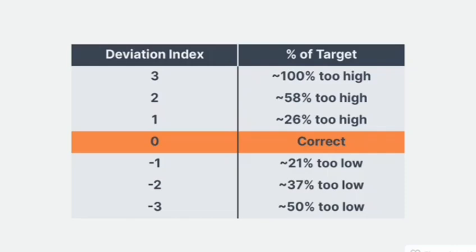These values do not measure image quality. There may be obvious artifacts, or there may not. These simply describe the accuracy of the operator's technique in producing the desired receptor exposure. The X-ray operator should review the exposure indicator or deviation index after every exposure so they know how they might adjust their technique in the future.